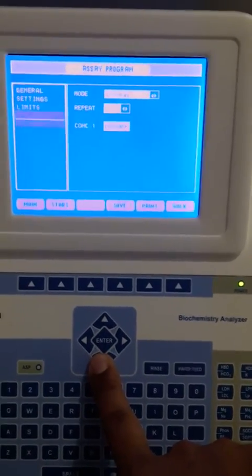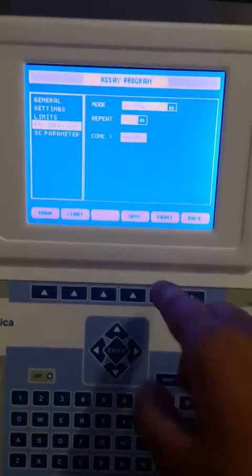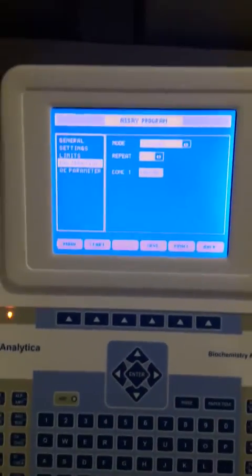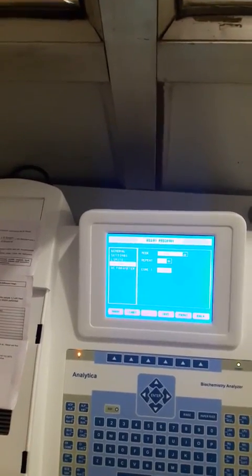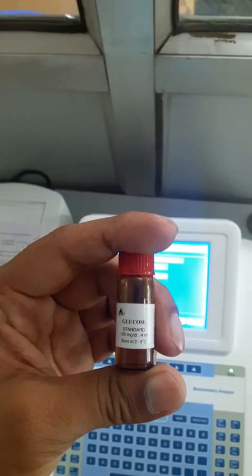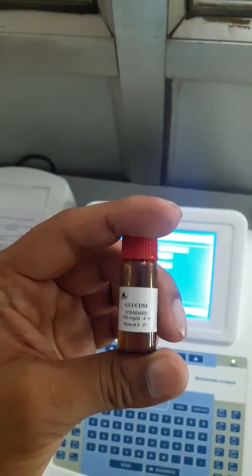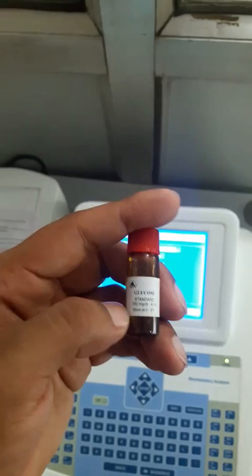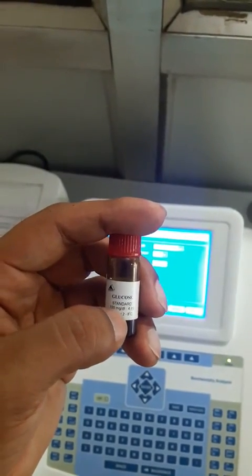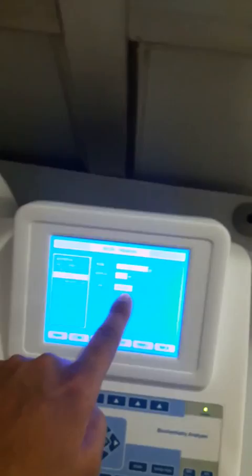Linearity is given as 0 to 500. The value of concentration we have entered is 100, as it is written on the standard. You can see on the bottom of the standard vial — 100 mg/dL is written — and the same value we have entered here.